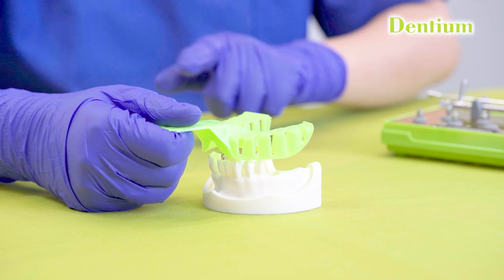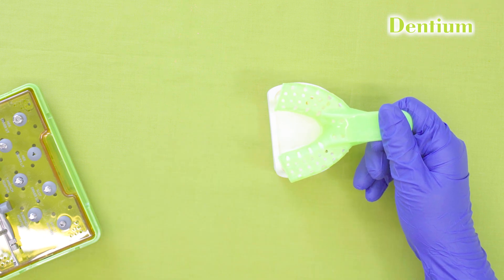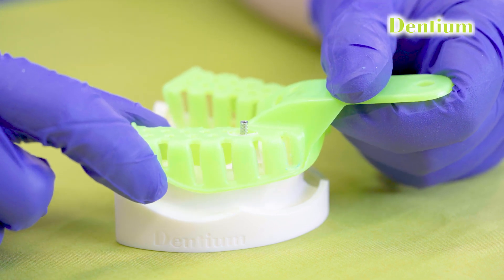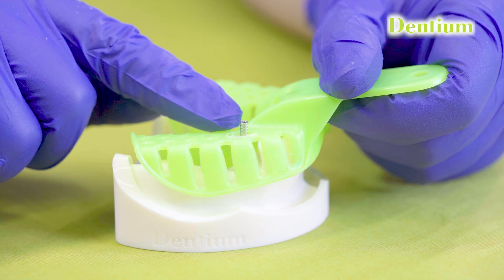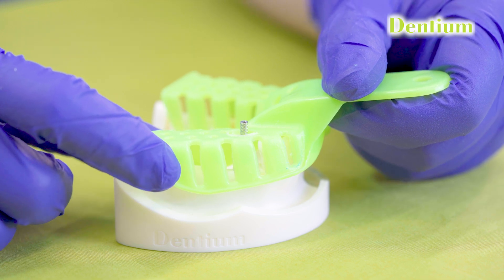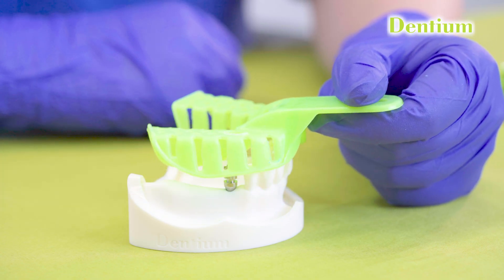Let's start taking the impression. We can use either a stock tray or a custom tray modified according to the case. Today I am using a stock tray in which I will prepare a hole that will allow the coping to protrude from the tray. Check whether the impression coping is protruding from the tray for easy removal of the screw while the impression tray is seated inside the patient's mouth. Verify that the tray fits properly without interfering with the coping.